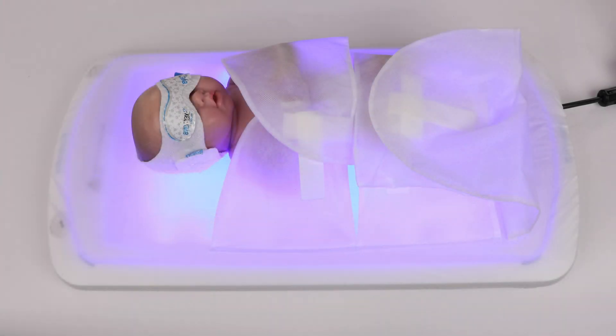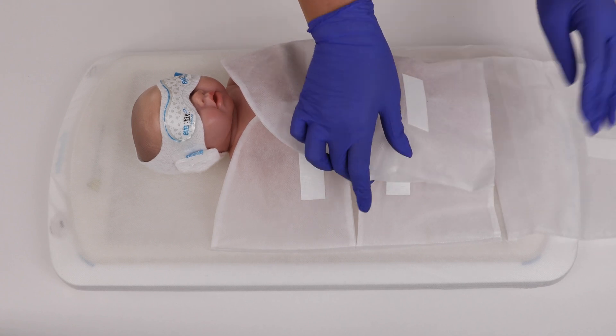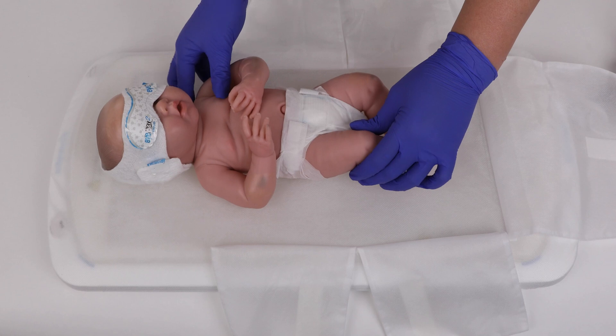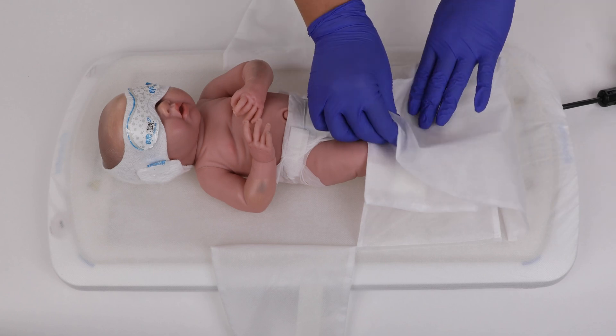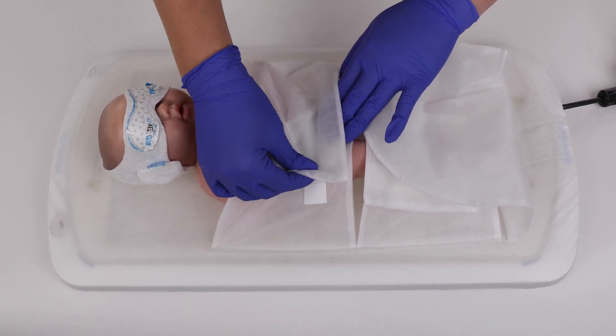The Skylife phototherapy system was developed to provide high quality, uniform light, which provides you the opportunity for intermittent phototherapy for your baby. Intermittent phototherapy means you can pause the device to feed, diaper, or care for your baby. When you are finished caring for your baby, continue the phototherapy treatment as soon as possible. The more time spent in phototherapy treatment, the faster your baby's jaundice will resolve.